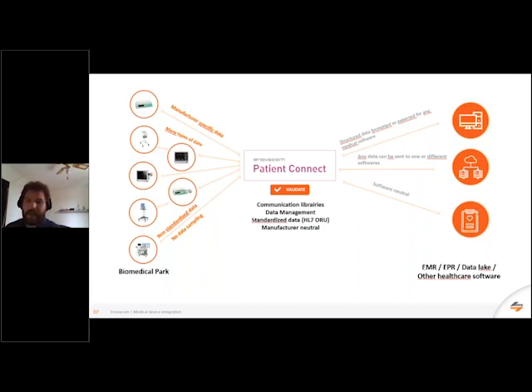On his side, Dave, as an IT administrator, considers many things, for instance, how information is exchanged. But software language is not generic. We need to provide data from devices to one or more than one software. Consequently, it would be perfect for maintenance if only one solution could collect data and send them to different software systems. Second point, those different software solutions have their own specifications to accept data.